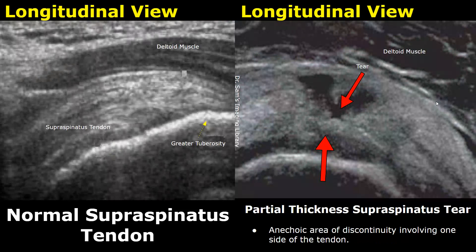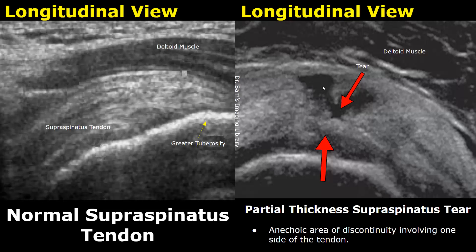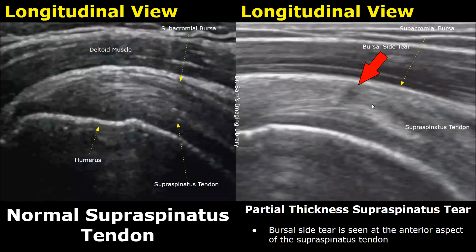This is a partial thickness supraspinatus tear. We see an anechoic area of discontinuity that involves only one side of the tendon — it does not go all the way through the whole thickness. Here is another image of a partial thickness tear; it is a bursal side tear because it is seen at the anterior aspect of the supraspinatus tendon, which is called the bursal side.